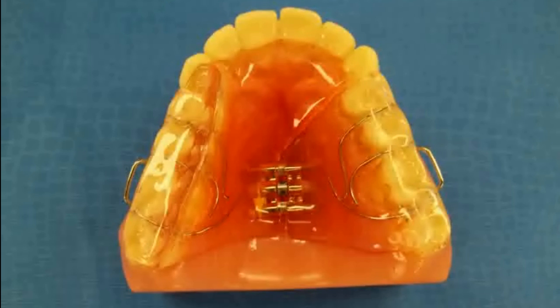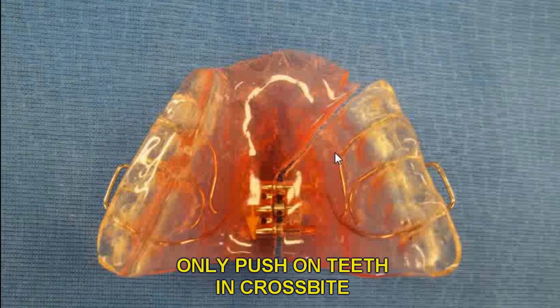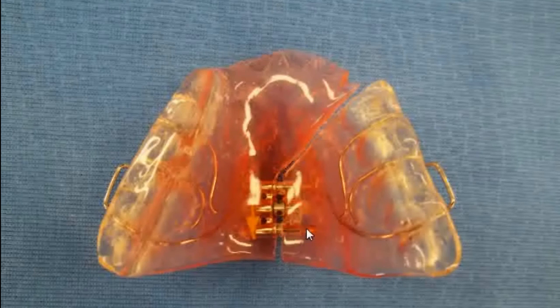The Nord crossbite appliance is similar to the Schwartz expander with a couple of differences. The first difference is the acrylic is cut at an angle, so it will only push on the teeth that are in crossbite. The remainder of the arch is used as anchorage. This will prevent this side that is in good occlusion from overexpanding.